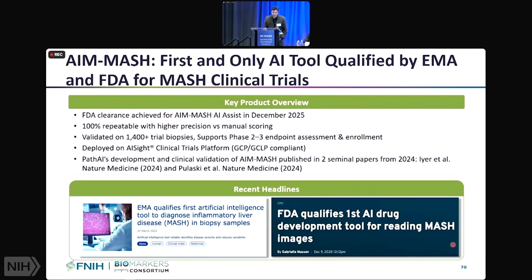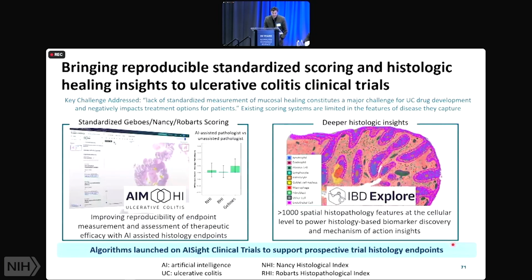that are in the scoring criteria, I would, to some degree, put in the category of pathologist impossible, to what Mike said, things like counting every ballooning hepatocyte in a slide when there could be 100,000 cells in that slide and people struggle to agree on even a single one. That's obviously an impossible task for humans, but it's a very feasible task for an AI system. So that was one big advance from last year.